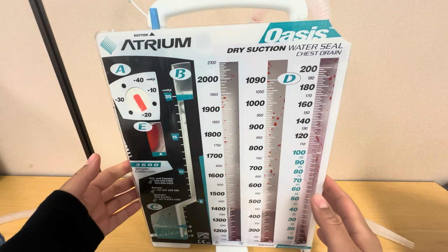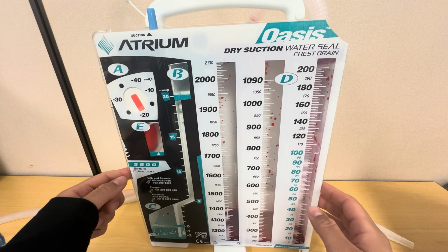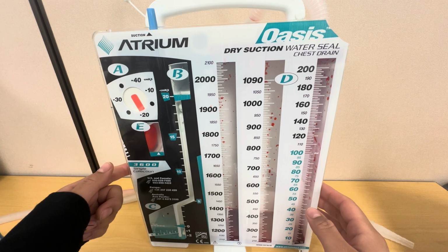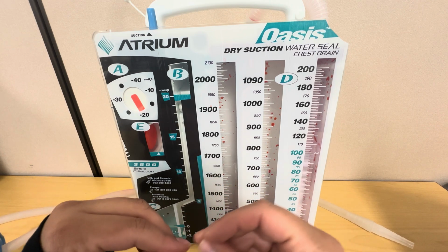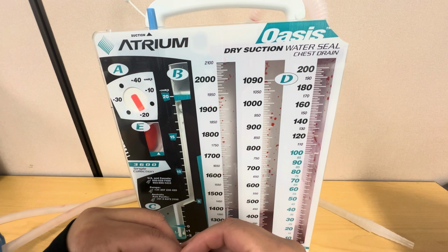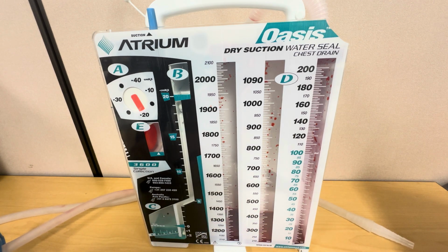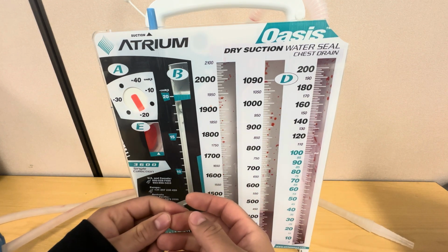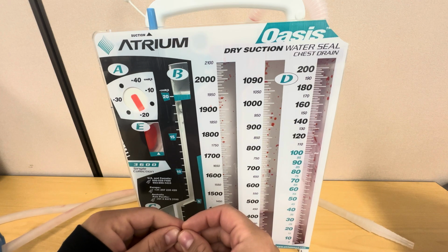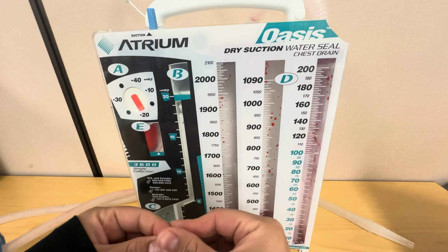The drainage system also needs to be kept below the patient's chest. That's very important. So we can either hang it on the bedside or we can keep it on the floor. They'll usually have a stand for us to put it. And as we mentioned, we want to make sure that it's always secure to the patient and it's free of any types of kinks. On top of that, we want to monitor a patient for their lung sounds and make sure that what's needing to be drained is actually being drained.